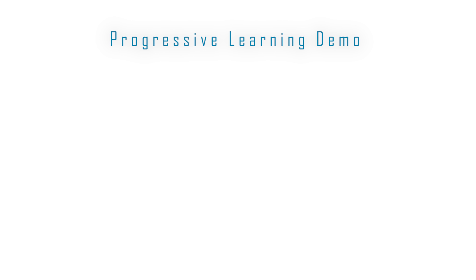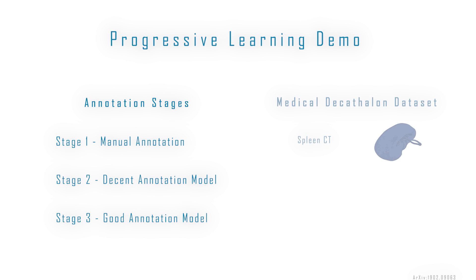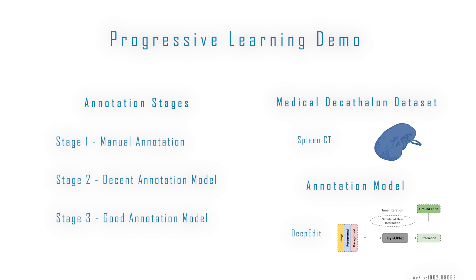To demonstrate the power of MoniLabel, we're going to walk through a three-stage progressive learning demo using 3D Slicer. For our data, we're using CT-Spleen images from the Medical Decathlon dataset, and for our model, we'll be using DeepEdit.